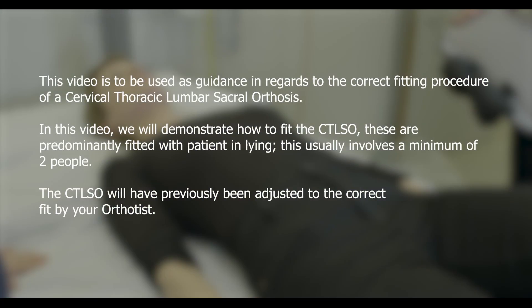This video is to be used as guidance in regards to the correct fitting procedure of a cervical thoracic lumbar sacral orthosis. In this video we will demonstrate how to fit the CTLSO.